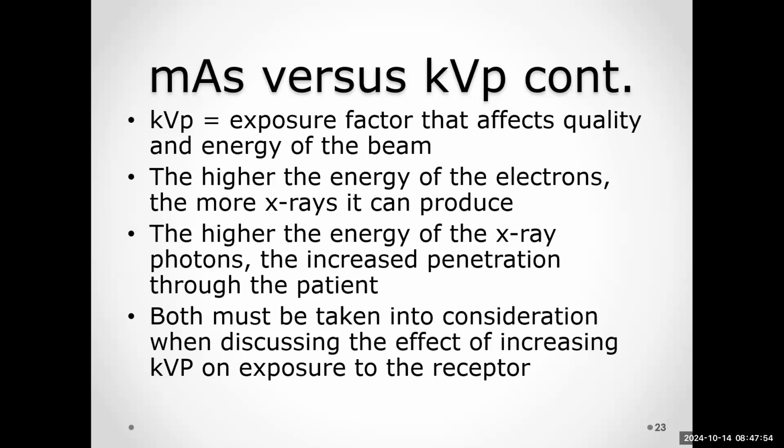So hear me now. You will see that question again. So star this slide, underline it, highlight it, if you want to get all the credit on the question that will be asked on the practical about why you have to make the change that you make. This is the why. Because there's more photons, we're talking about higher kVp, there's more photons created to begin with, and of those photons, they have higher energy.